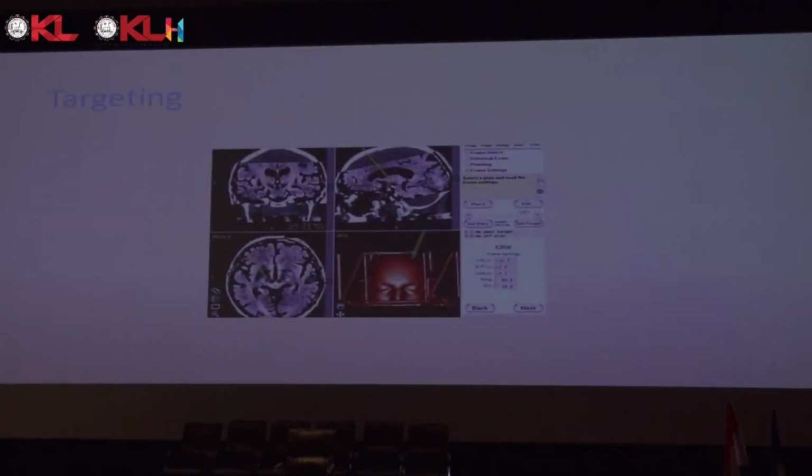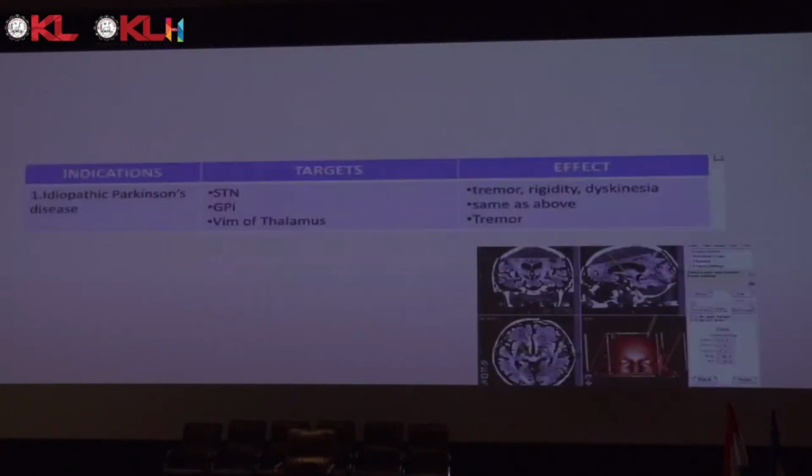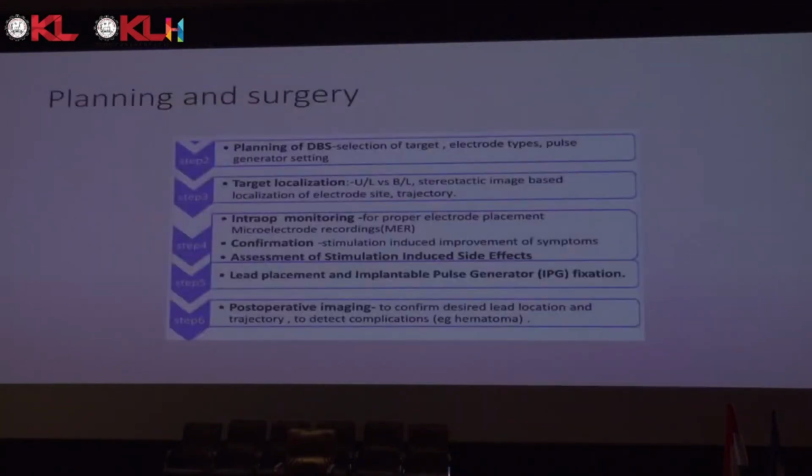This is a CT scan, this is MRI, this is CT scan. We merge both and use these to get the targets. With these targets, we target. We do intraoperative monitoring and assessment, stimulation, and finally lead placement. After that, we do a post-operative CT scan.